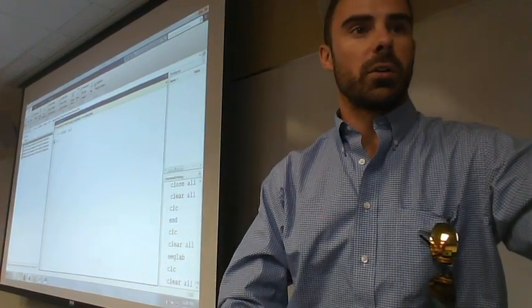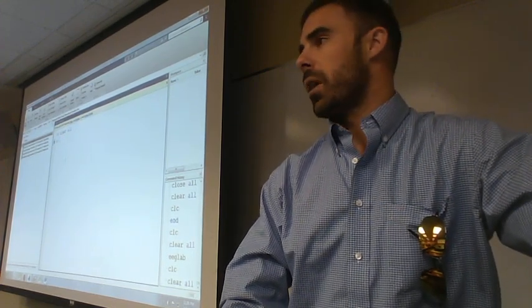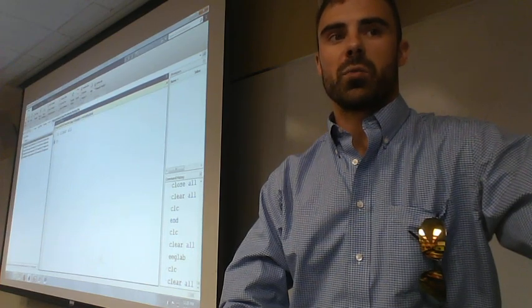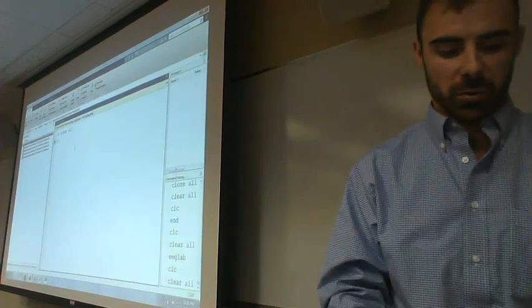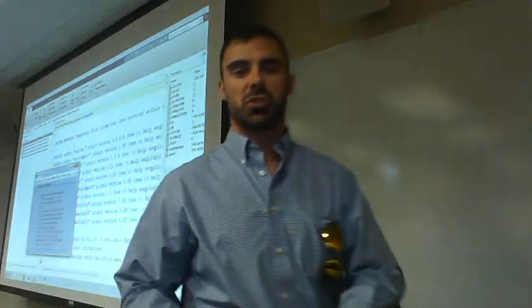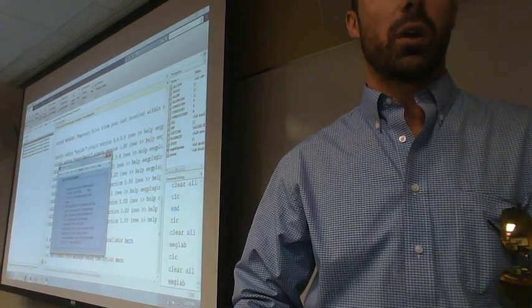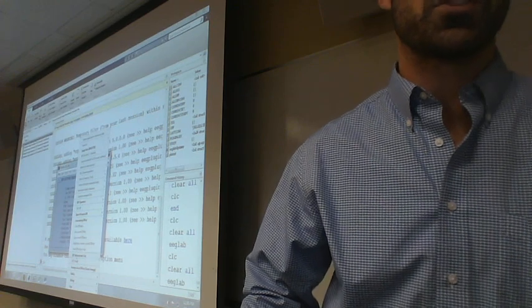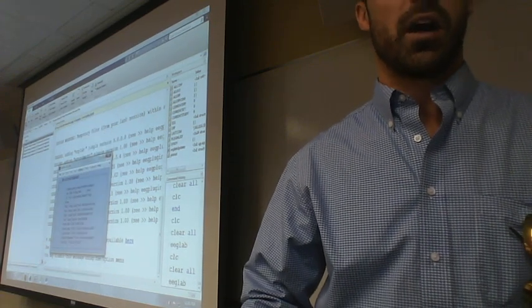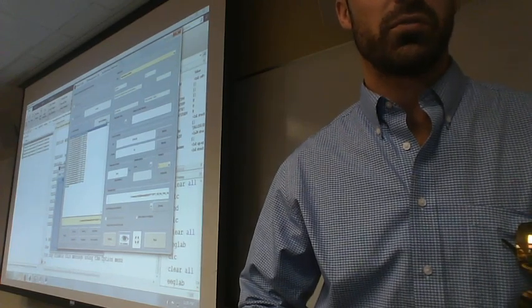So here we are. I'm in my EEGLAB folder, and I've downloaded the folder that we had in box.com for topographic analysis, range normalization procedures. First thing we're going to do, of course, is open EEGLAB. So I'll type eeglab. We see that happen there. Okay, so now we bring up the EEGLAB GUI. And what we need to do is extract these simple statistics. So for example, what I will do is open our ERP measurement tool within the ERPLAB menu. In this case, I'm actually going to clear all these ERP files.